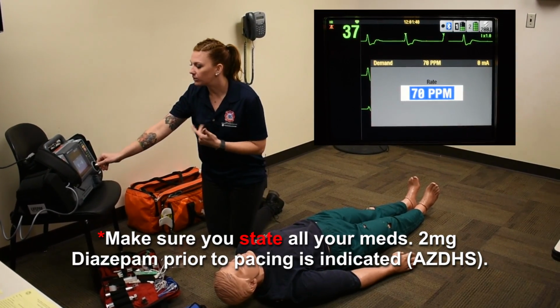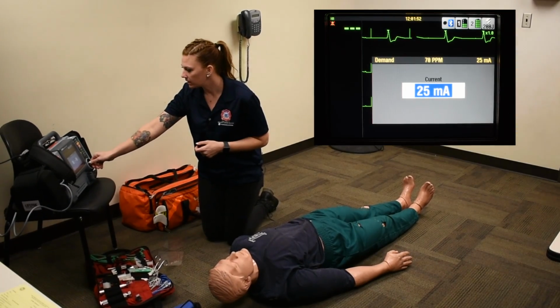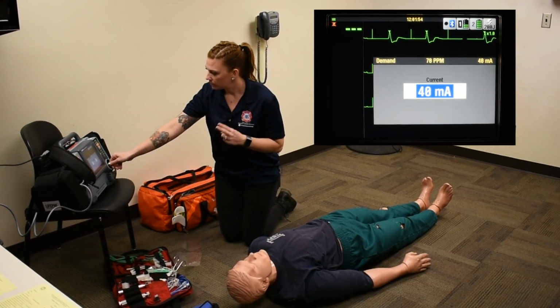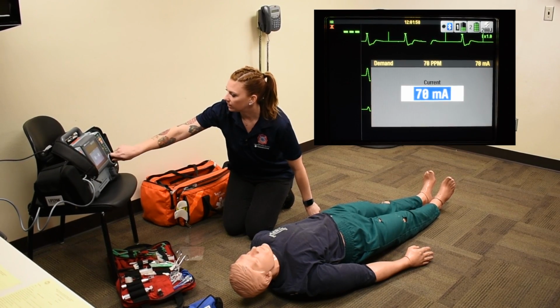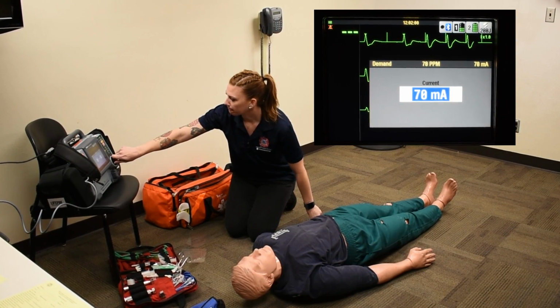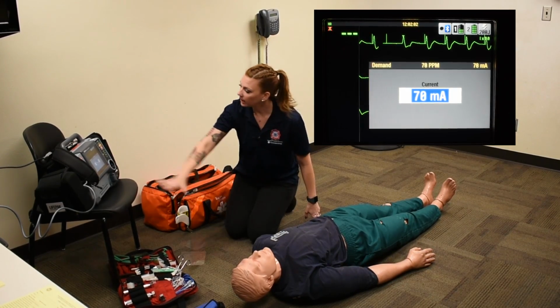I'll set my rate at about 70 to start with, and go ahead and turn up my milliamps until I have capture. So I'm going to keep my fingers on his pulse here and just see if I can go ahead and capture. You've achieved mechanical capture. Okay, so I feel a rate of 70 here. I see a rate of 70 here.